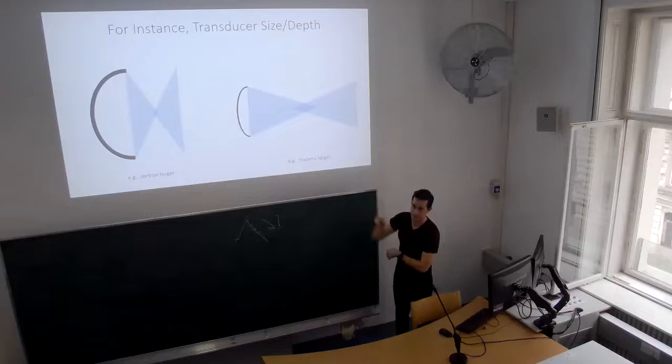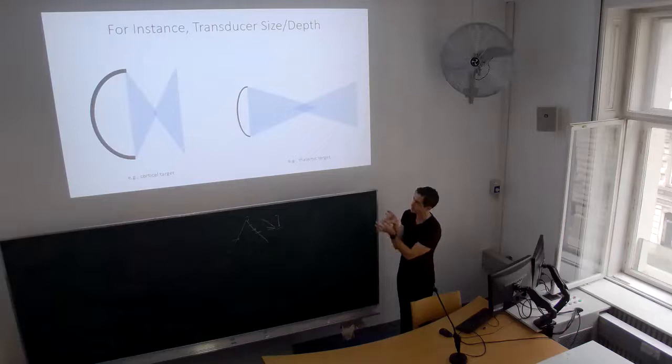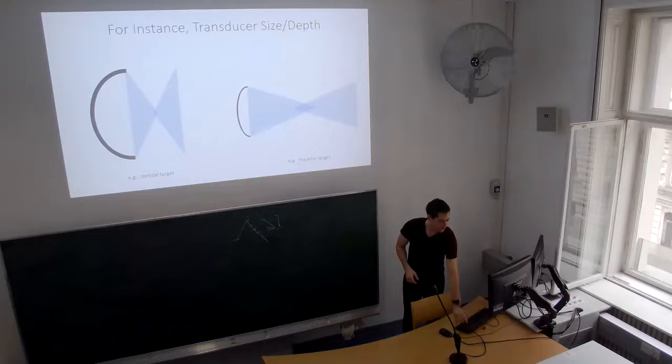When you're deeper, it simply has to be a longer focal point. If you have a smaller transducer or it's deeper, you're going to have more of an elongated focus. It's like this little sausage sort of shape. That would be like targeting the thalamus right in the middle of the brain, which is what I'm used to. So it's really precise up, down, left, and right, but it's more elongated. And so you're also impacting nearby stuff like the basal ganglia. Okay.